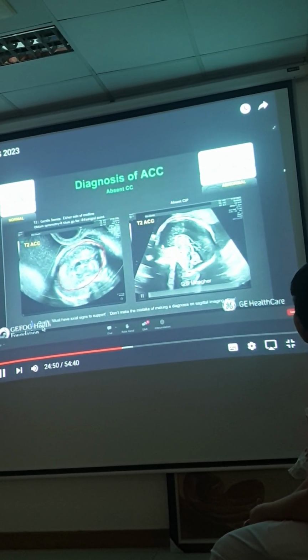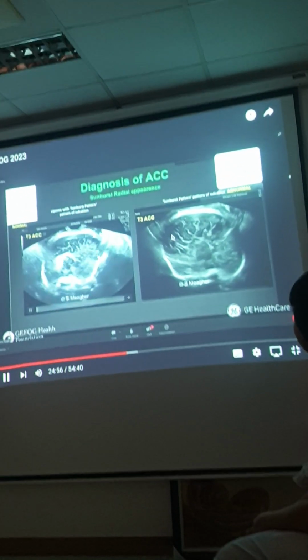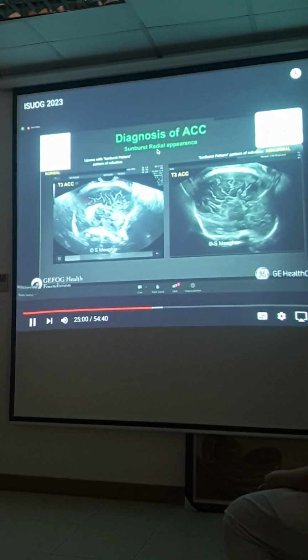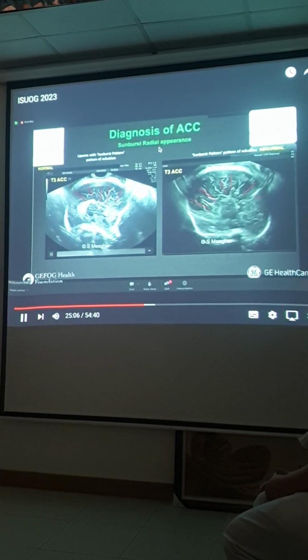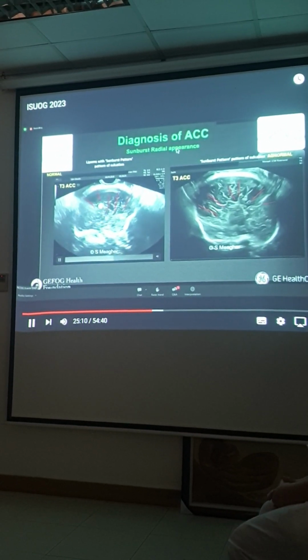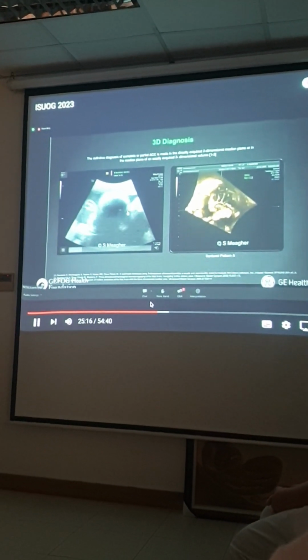As I scan these features, phải có những cái dấu hiệu ở trên, đúng không? Trên cái mặt cắt dọc là những cái khó nên các phòng khám không thấy. In the third trimester it's so much easier because when you look at the actual radial burst, trên mặt cắt dọc ngoài cái dấu mình không thấy cái thể chai, mình sẽ thấy cái hình ảnh gọi là như mặt trời, như tia nắng mặt trời, sunburst, radial. Đó là những cái rãnh nó nổi lên, nó đi ra.